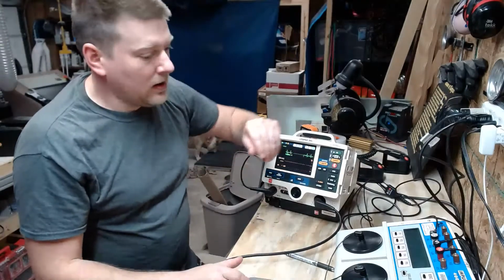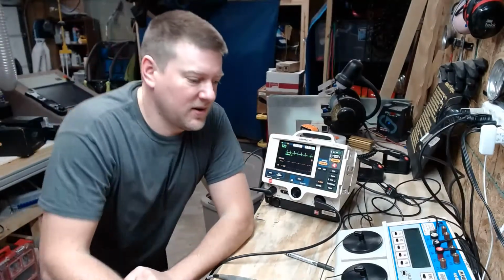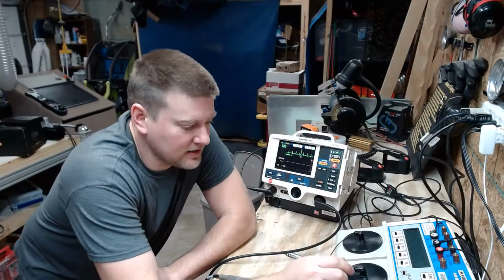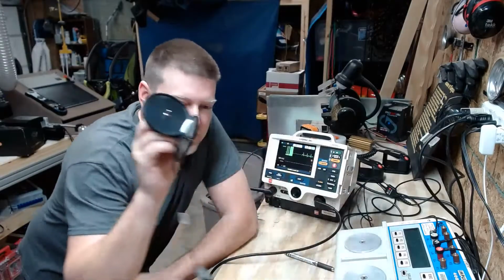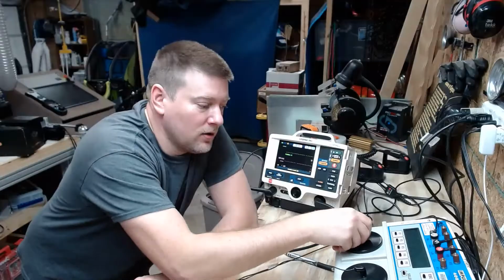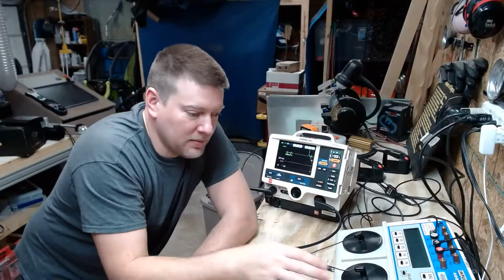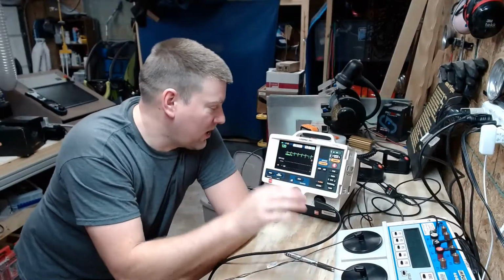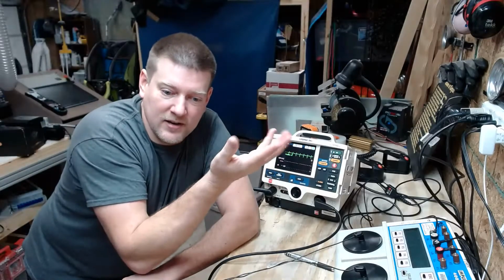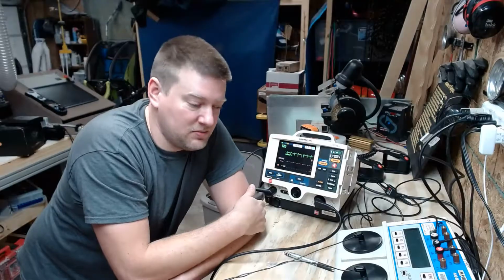There we go. So here's a crazy thing about these older analyzers. So you see how it's got these adapters. Normally, you want them color coded or something, because if you put them on wrong, you can see what you get on your defib. You get an inverted waveform, so the polarity is backwards.